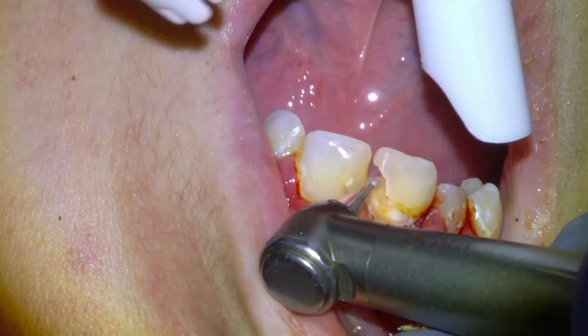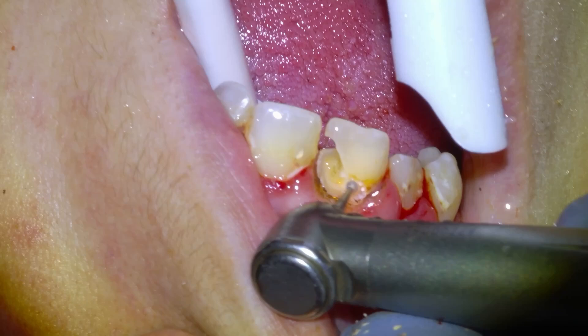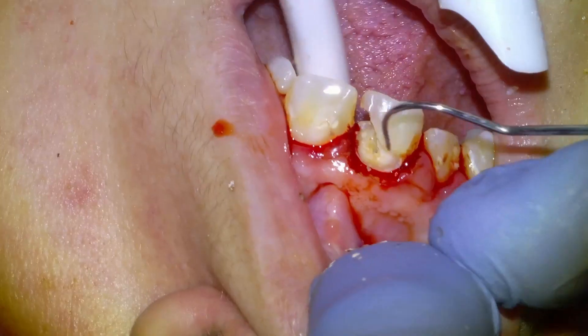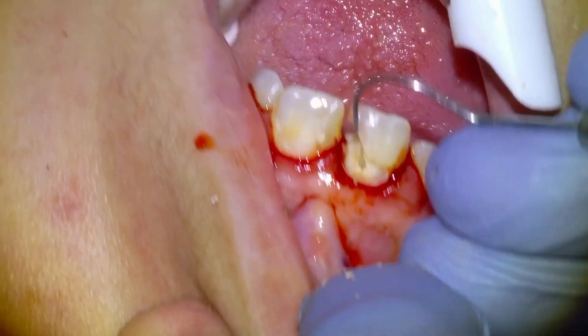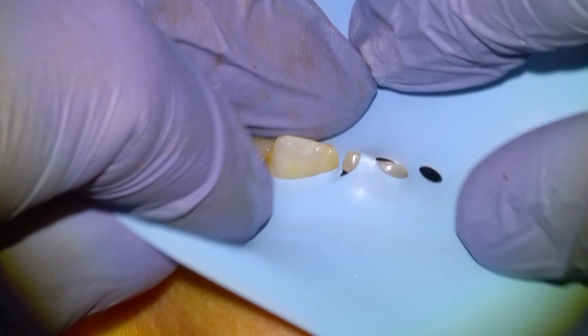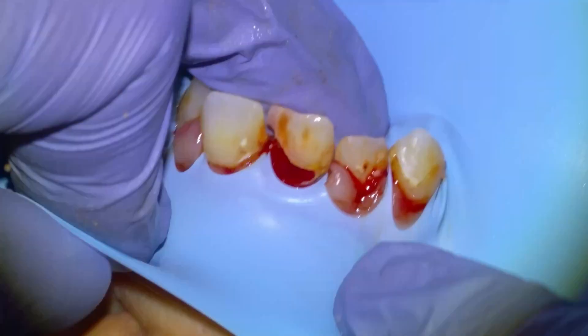We're going to refine the tooth with this high speed burr, and I actually plan to do the filling first and then the root canal second. The root canal is usually done from the tongue side, but we actually accessed the pulp chamber pretty cleanly from the cheek side, so I decided we would do a buccal access root canal on this central incisor. We're going to put the rubber dam on to separate the working field from the rest of the mouth.